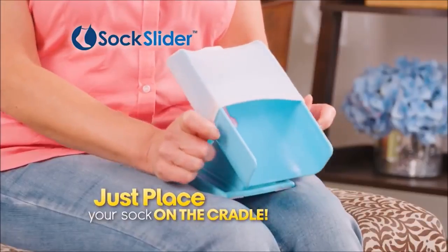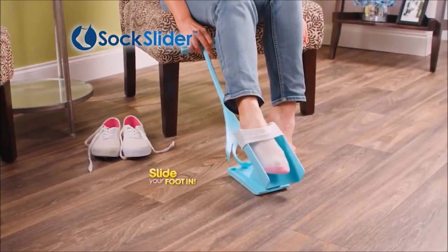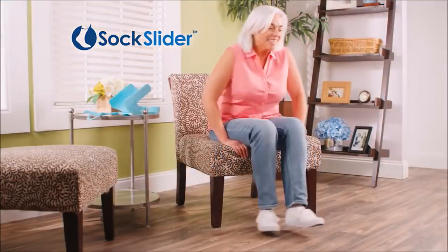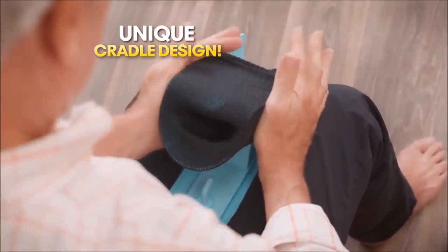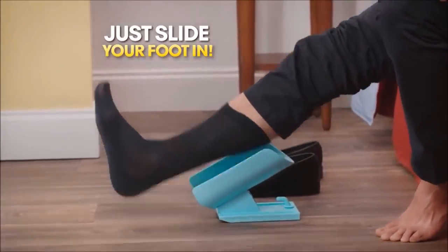Just place your sock on the cradle, lower the cradle to the floor, and slide your foot in. It's that easy. Sock Slider puts the socks on for you, so bending over is something you never have to do. The secret is the unique cradle design that expands the sock opening and places it in the perfect position, so all you have to do is slide your foot in.